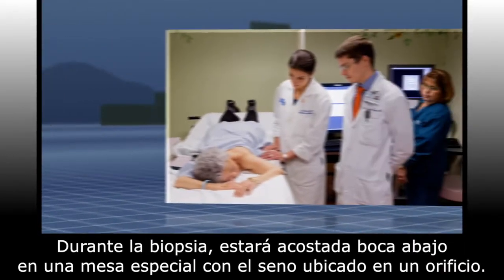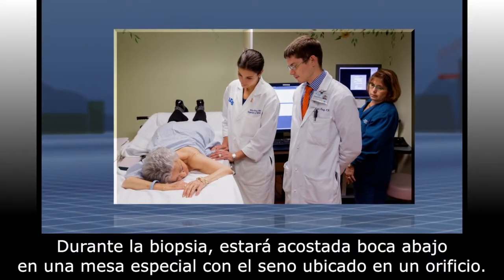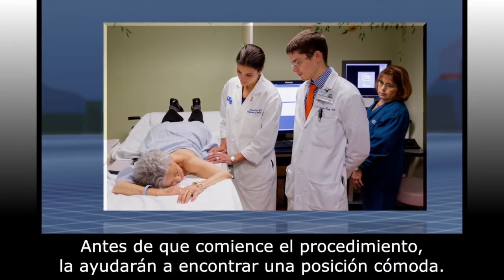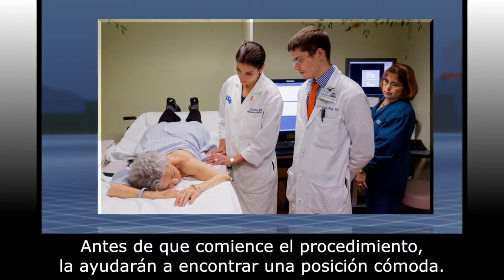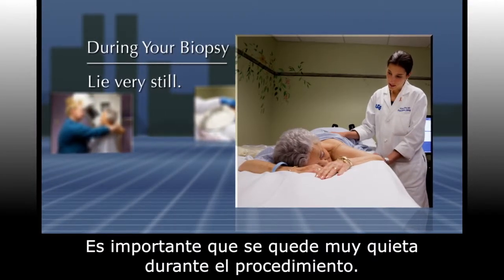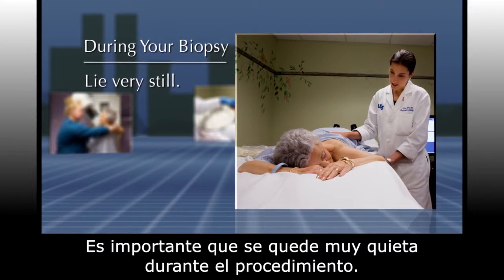During your biopsy you will be lying on your belly with your breast positioned through a hole in the special table that you're lying on. You will be helped to find a comfortable position before the procedure begins. It is important that you lie very still during the procedure.